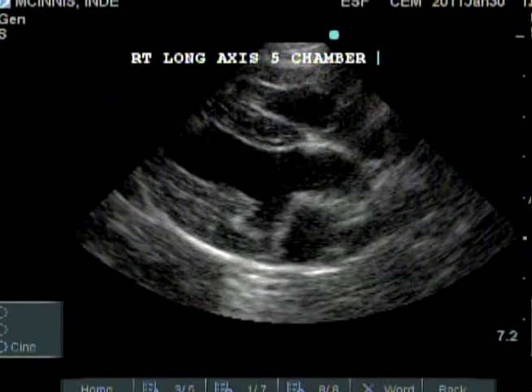This is the right side long axis 5-chamber view of the heart.